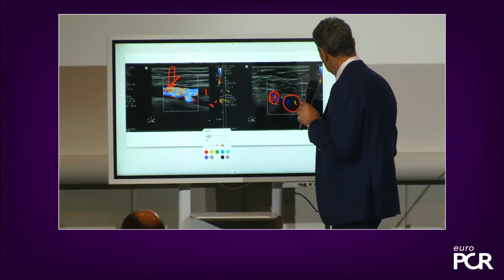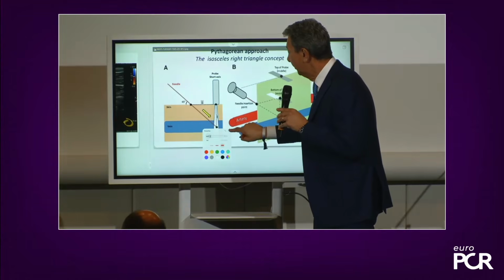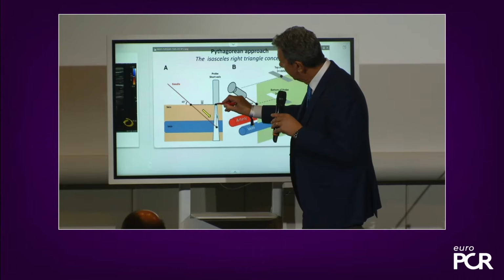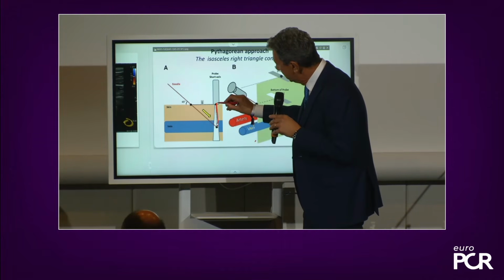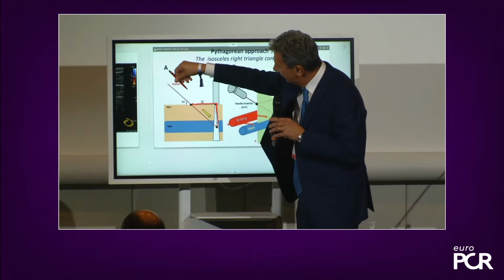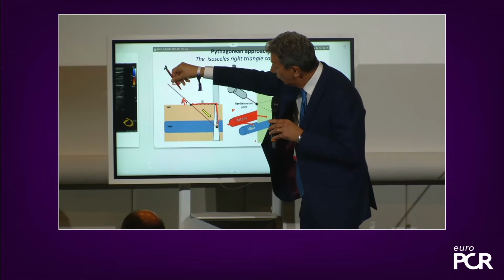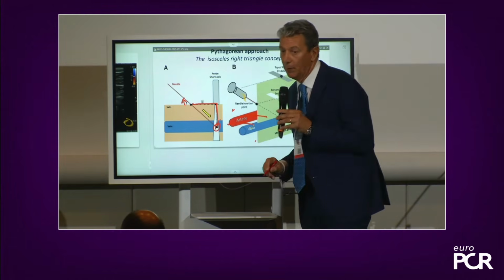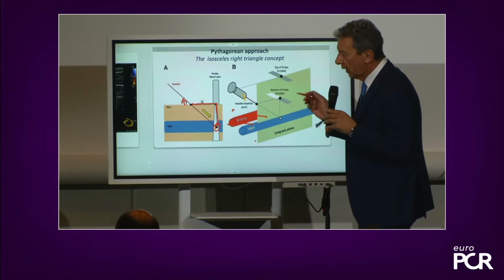I recommend this approach. This is a mathematical approach for a perfect puncture. You have to measure the distance from the skin to the vessel. You transfer this measure on the skin. You keep the needle at a 45-degree angle, and when you advance the needle, you will be exactly under the echo beam. Okay? Francesco, I think we can go on.